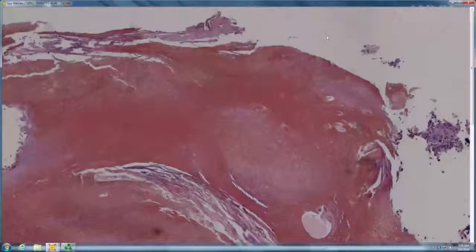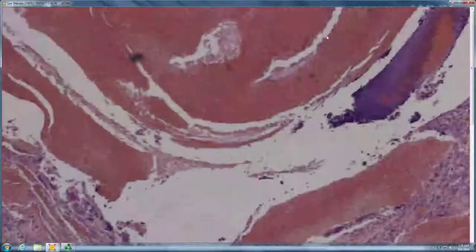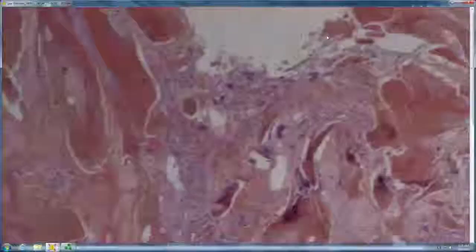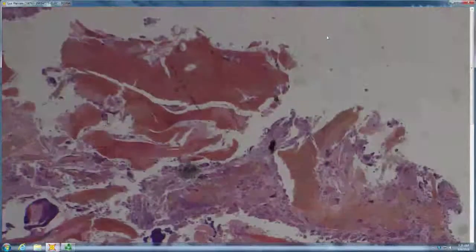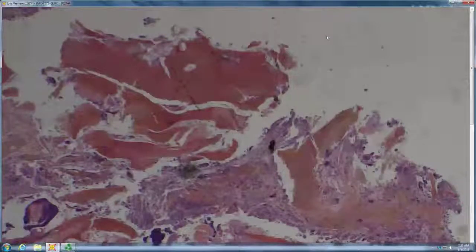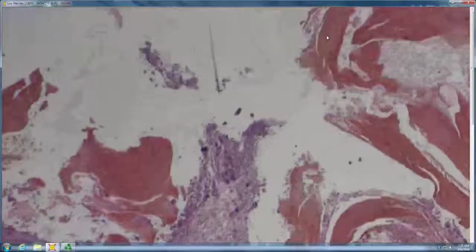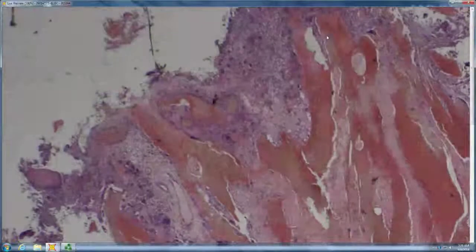So, I see a lot of shadow cells, which suggests pilomatricoma. So that suggests pilomatrical differentiation, and they can calcify, and then in this case you have some osteoid formation. So when there's osteoid forming, the residents like to joke that then you get to say it's a bona fide example of a pilomatricoma. Right? Bona fide. Very funny. Okay.